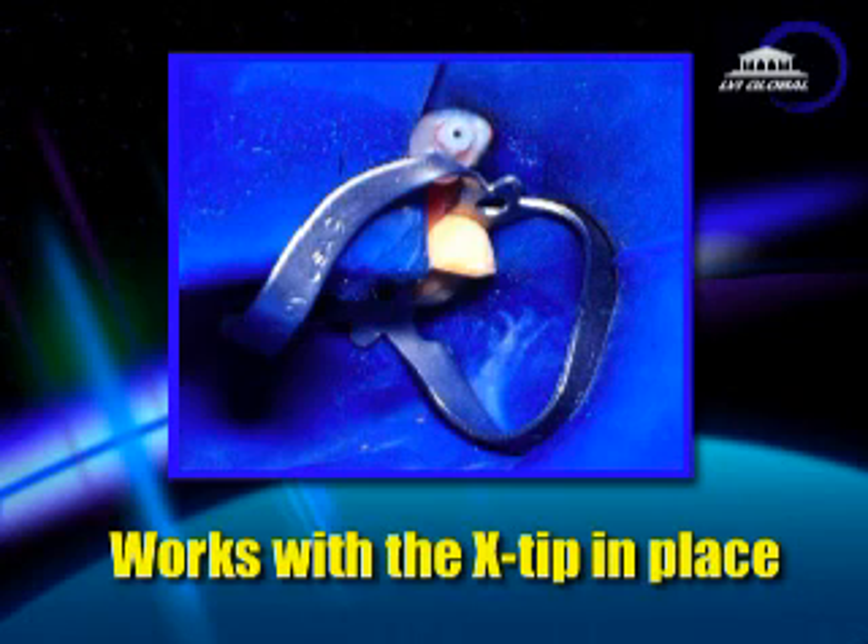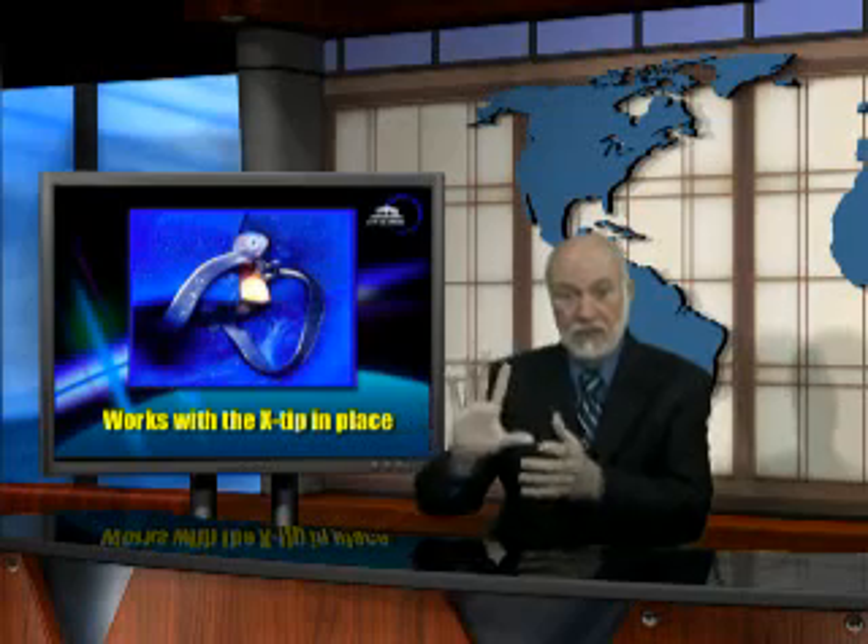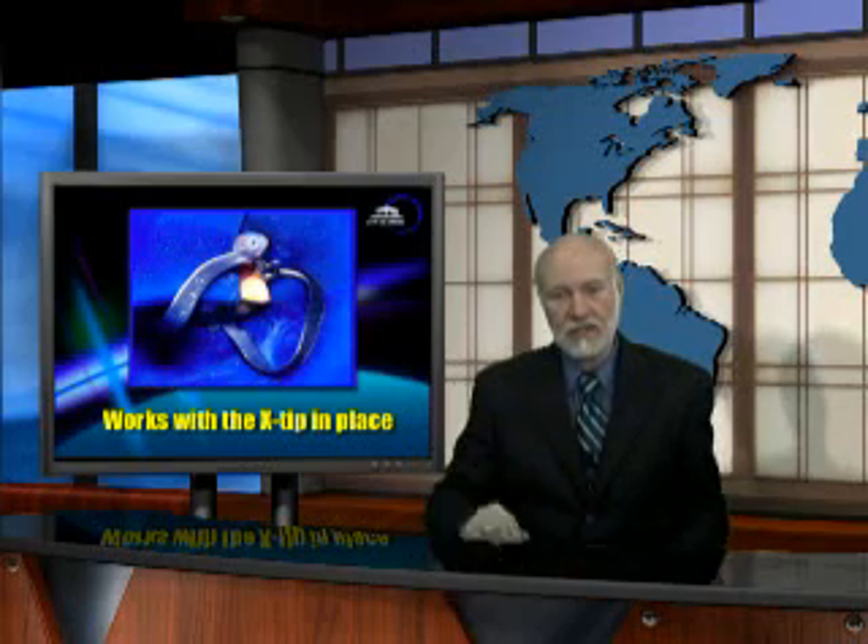The number 9 clamp works beautifully with the X-Tip intraosseous system. If you place the X-Tip, numb the tooth, and slip the rubber dam over the tooth and the guide sleeve, many times you won't even need to have a rubber dam clamp. But in the cases where you do need the clamp, you slip the rubber dam over, then you add the clamp, and it will hold everything nicely in place.